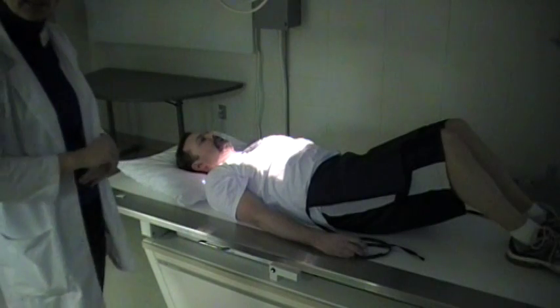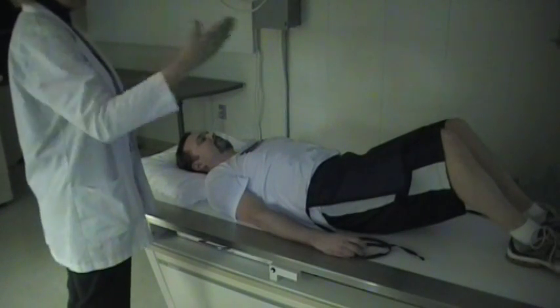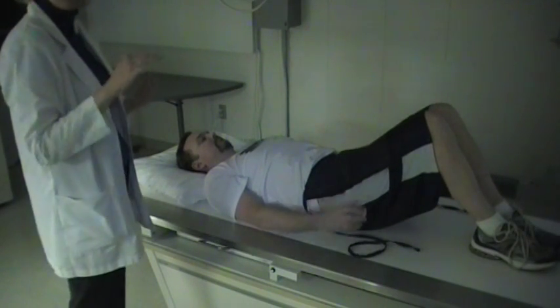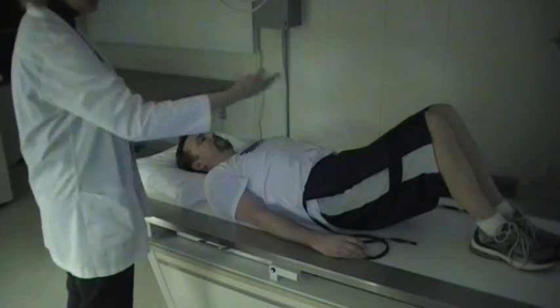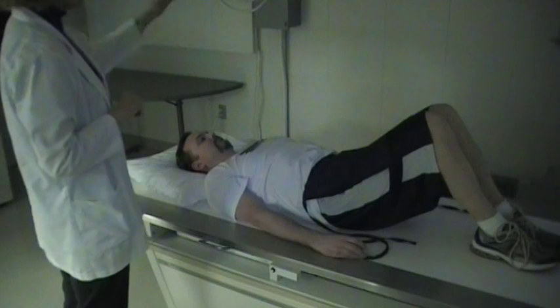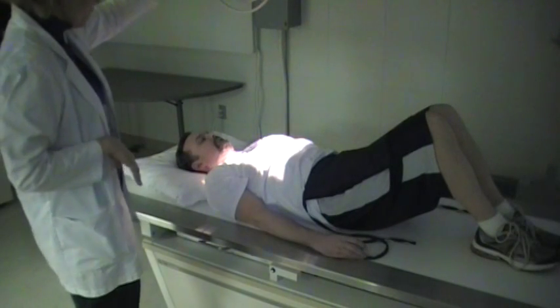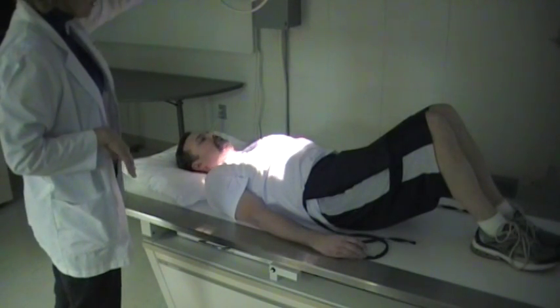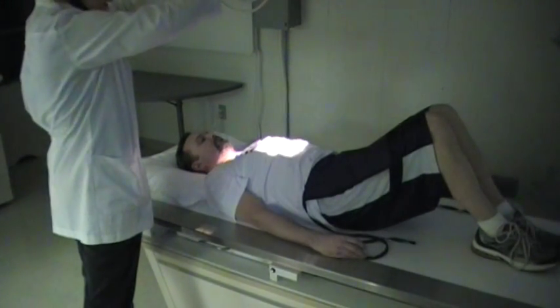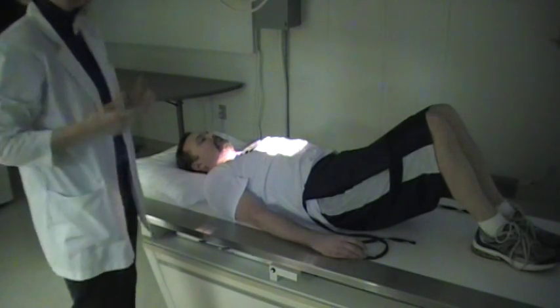Now we're going to be doing the thoracic spine X-ray. When you have your patient laying down on the table, go ahead and have them bend their knees up. This takes out some of that curvature of the spine so that the spine is laying flat against the table. Go ahead and lay a lead apron across the lower pelvis. I'm using a 14x17 image receptor or 35x43 cm image receptor — go ahead and use the complete length of it. We can collimate in on the sides so that we're only including just the T-spine and not the entire chest.